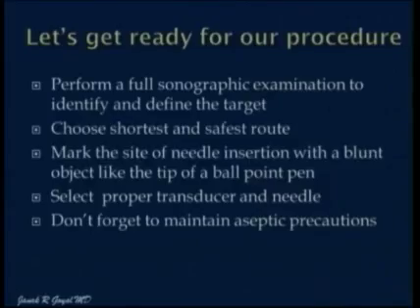So let's now get ready to do some procedures, and I will show you some of the common procedures which I perform under ultrasound guidance. I will not be showing you anatomical details, but I will try to show you the area of injection in some of the anatomical areas.